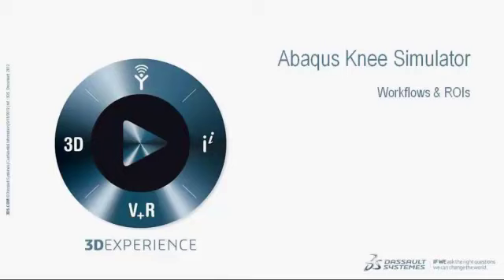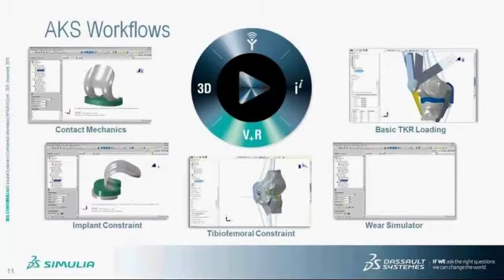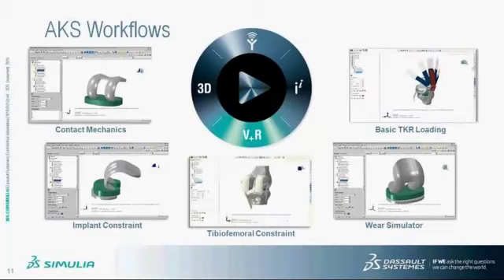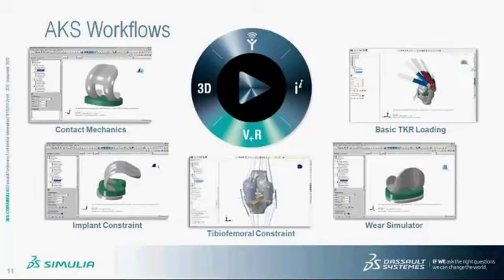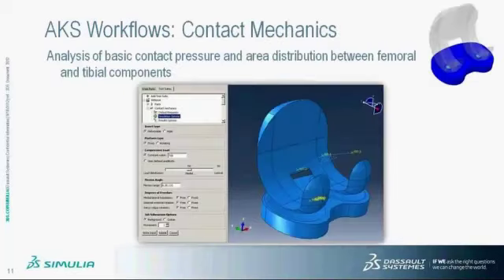Next, we will talk about the workflows in depth inside Abaqus Knee Simulator. The Knee Simulator includes 5 workflows. They are the contact mechanics workflow, simple implant constraint workflow, the tibial femoral constraint workflow, wear simulator, and the basic total knee replacement loading workflow. The contact mechanics workflow is the analysis of basic contact pressure and area distribution between the femoral and tibial components during a simple knee flexion.